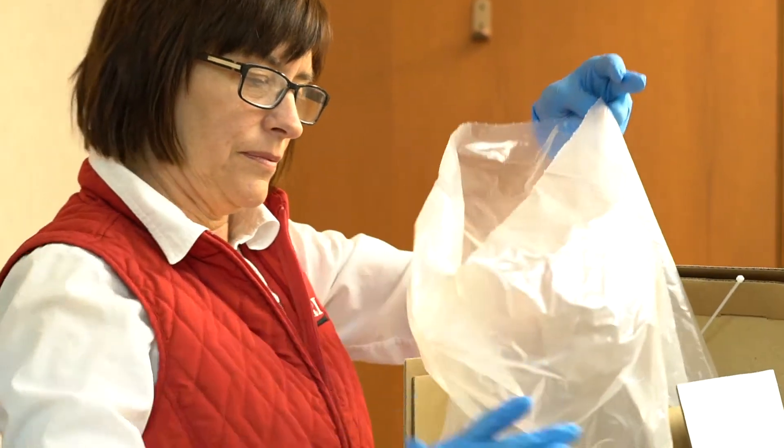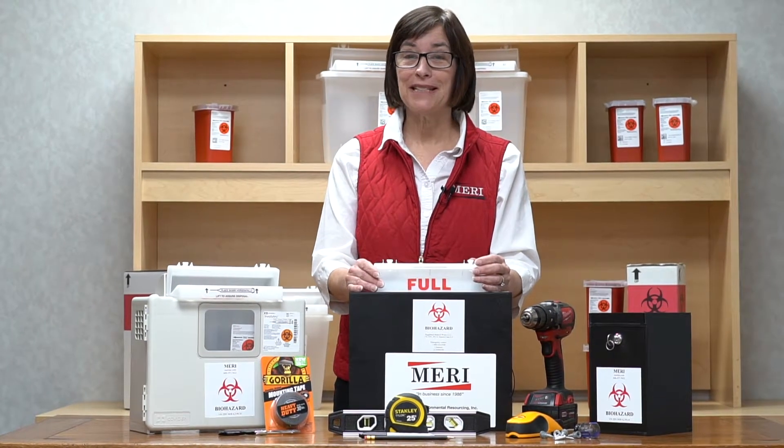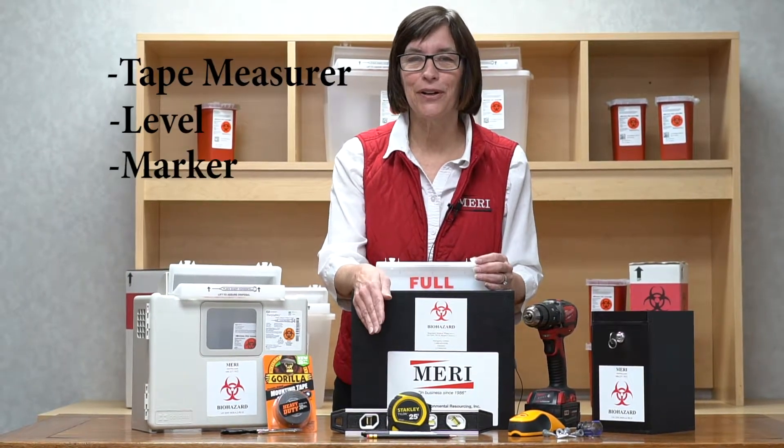Today we'd like to review the instructions on how to properly hang your sharps box and replace the insert when it's full. Before we begin, you'll need a few items including a tape measure, level, and marker.